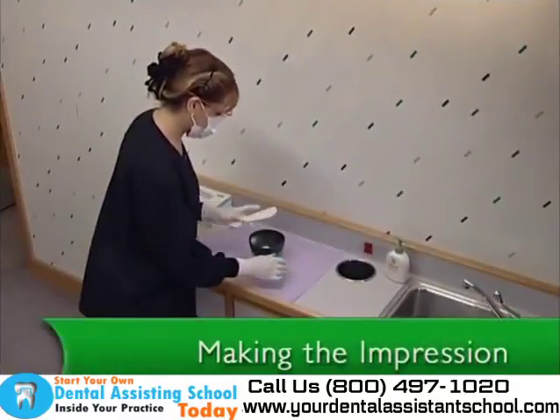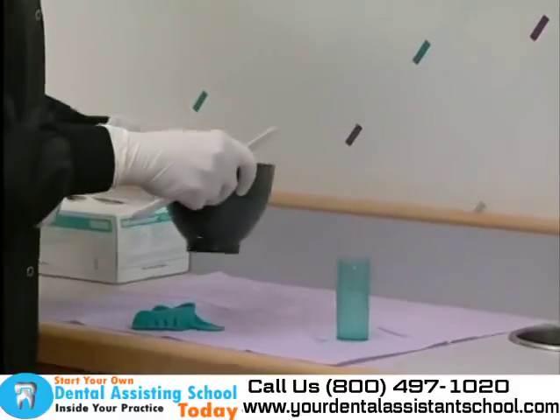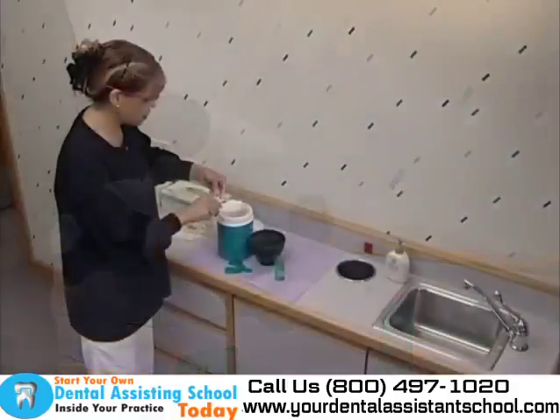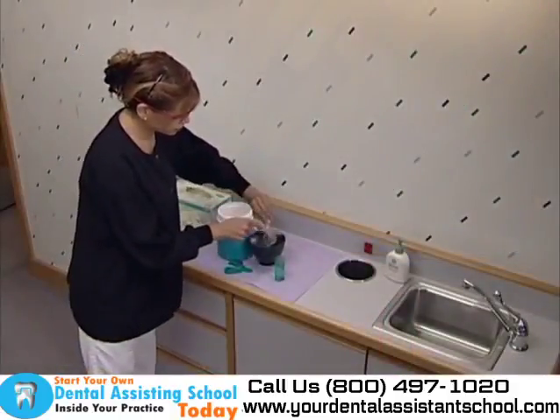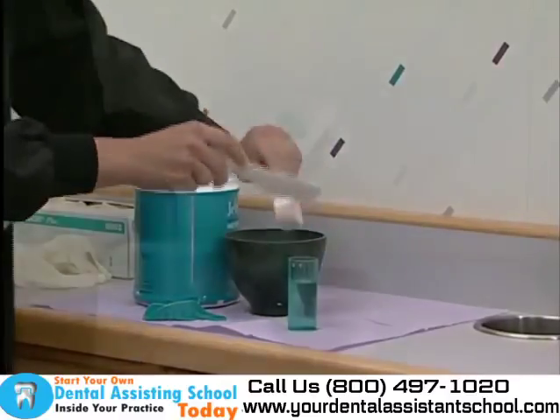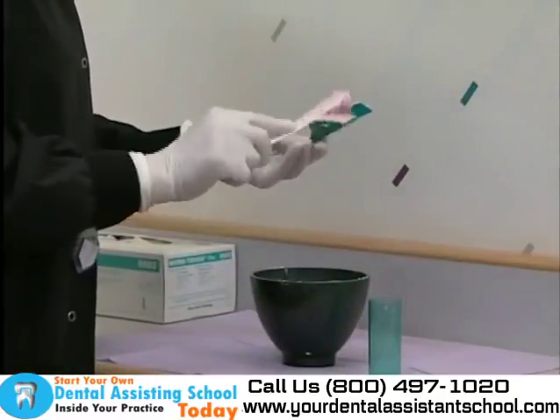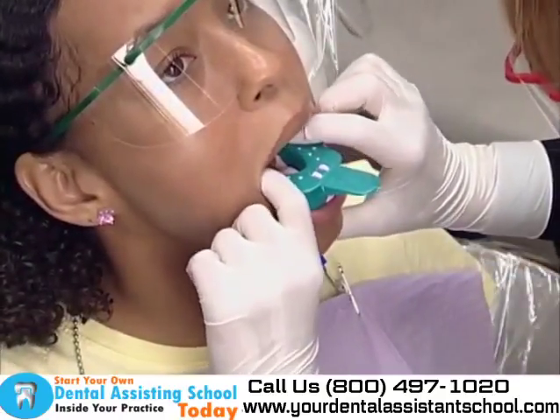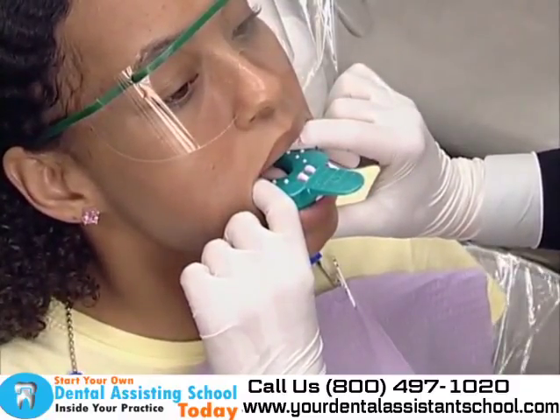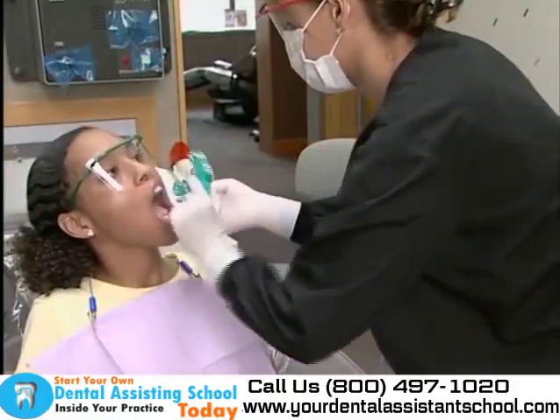The dental assistant is ready to make the impression by mixing water and alginate in the mixing bowl with the spatula. The manufacturer's instructions are to be followed, as different brands of alginate require a different ratio of powder to water. The material is then put into an impression tray that is the correct size for the patient's arch and placed into the mouth. The assistant holds the impression tray for approximately 1 minute, or until the material sets, and removes it from the mouth.